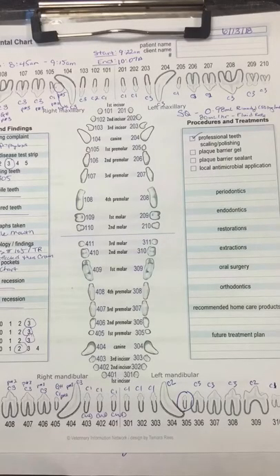Charting is strongly recommended for every dental procedure. This documents the extent of disease and can be used for comparison in the future. After the procedure is done, this chart should be scanned and placed into the patient's file.